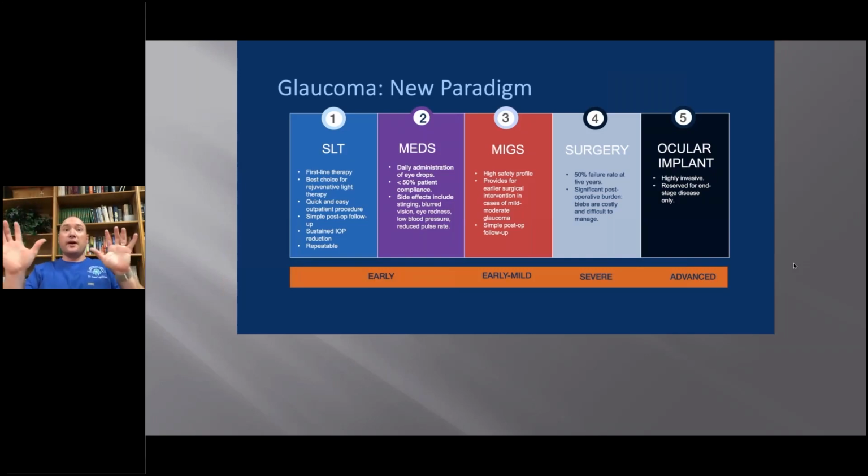So you want to give yourself as flat an approach to the trabecular meshwork as possible. So when you've got the laser lens on the eye, let's view it in really two parts. If your view is blocked and you want to open up your view to give yourself a wider and better view, you want to tilt your lens towards the blockage, meaning, okay, I need a better view to the left. Tilt your lens to the left. I need more view to the right. Tilt your lens to the right. So to open up your view, you want to give yourself a tilt towards the blockage.